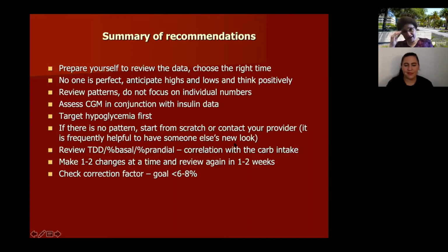I do it sometimes with the patients, and they ask, what's going on with my numbers? I said, why don't you just send a picture? Our dietitian loves it. She would say, send me the picture of your meal. When I was calculating with a few of the patients, I would ask, how many grams did you bolus for? The person would say, I calculated 35. And I said, I actually Googled everything on the plate, and I calculated 85. So now I know when it's really high. So have someone else take another look at it.